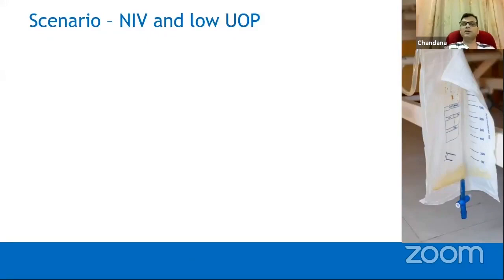I have a certain scenario. I think I have about another 5 to 10 minutes. I'll try to discuss one scenario which is important when you connect NIV to a patient. This is very common in hypoxemic patients who have been quite sick at home, and when they come, they are dehydrated. This is a real situation that happened in a certain hospital.